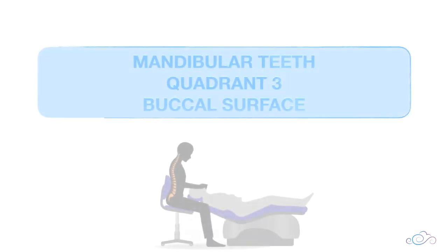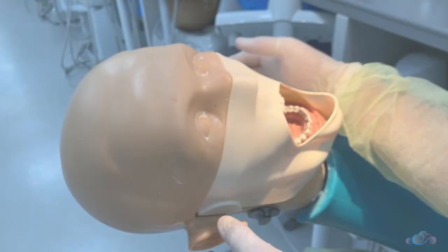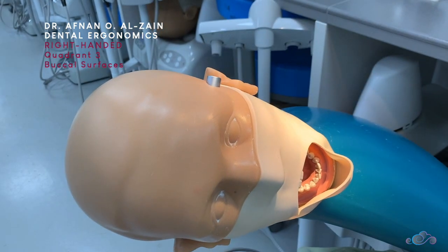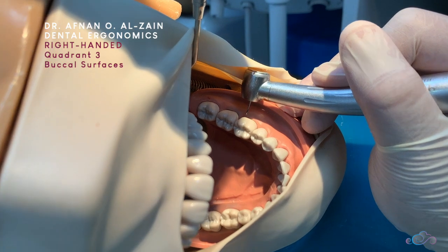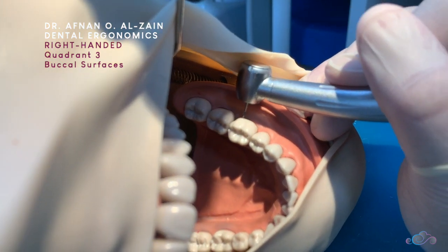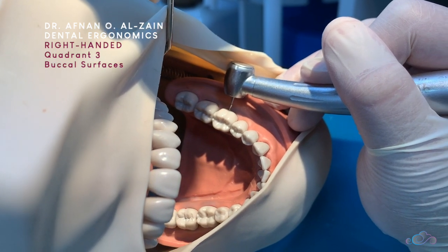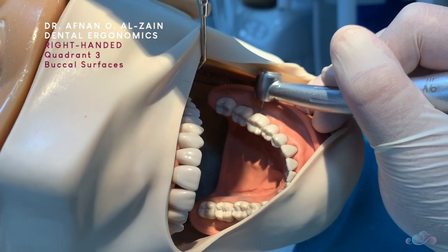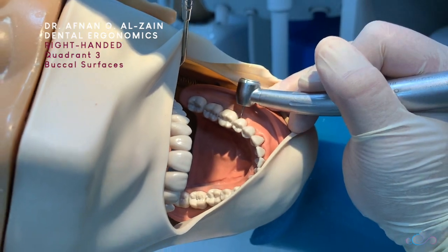Moving on to the ergonomics when working on the buccal surfaces of quadrant three. You're going to tilt the dummy head a little bit more, then place the burr perpendicular to the surface you're going to prepare. Place finger support in the alveolar bone, make sure that you're perpendicular to the surface following the contour of the tooth, and make sure you can see clearly.